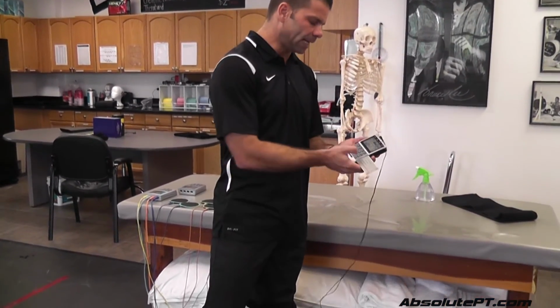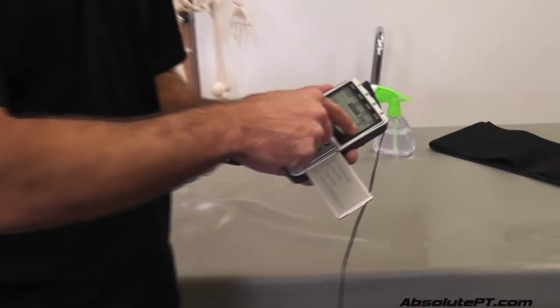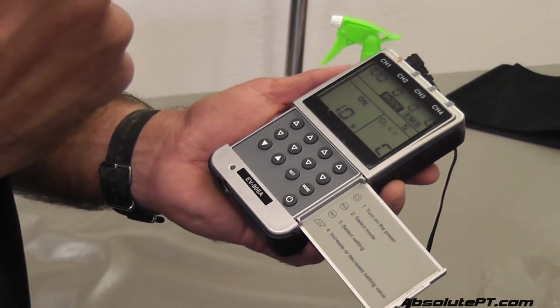It's wanting to push me over, but it's not lifting me up. And now I want to get off of C, okay, press mode one more time, and now I go to S. So that's going to give me a 10-second contraction, followed by 50 seconds of rest. So it's pushing me around a little bit.